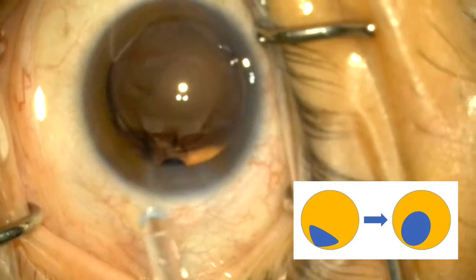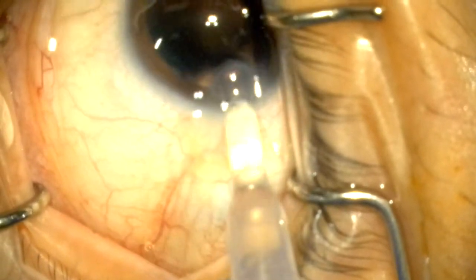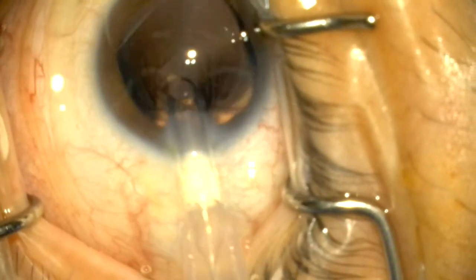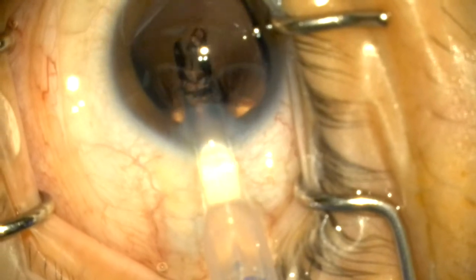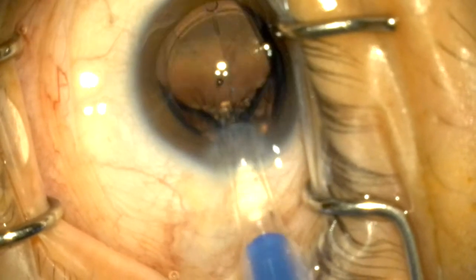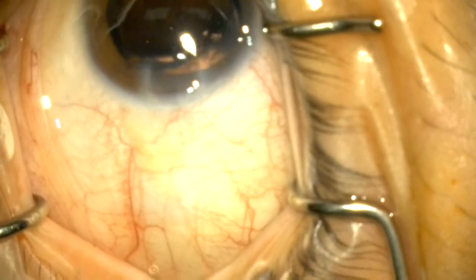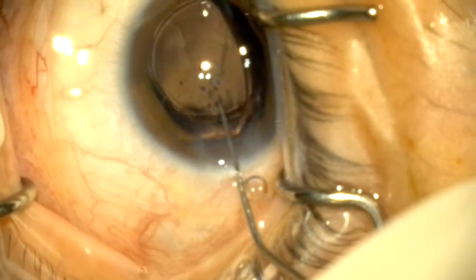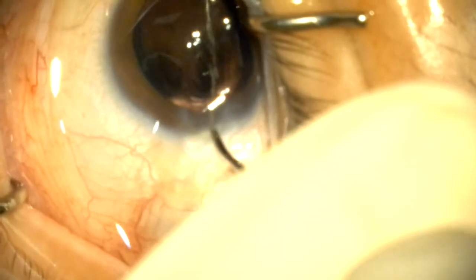As things look pretty stable, I have decided to use the intended trifocal toric lens to put in the bag as planned. This is a Zeiss AT LISA trifocal lens, which is a plate haptic. Once inserted, it can be turned both clockwise and anti-clockwise. I inserted the leading haptic into the bag first, and the trailing haptic remains in the AC. The trailing haptic is then gently nudged into the bag by using a lens dialer. The lens is then dialed into position of the intended axis.